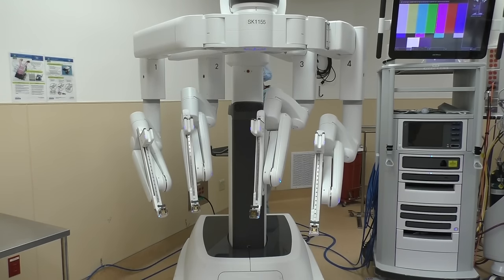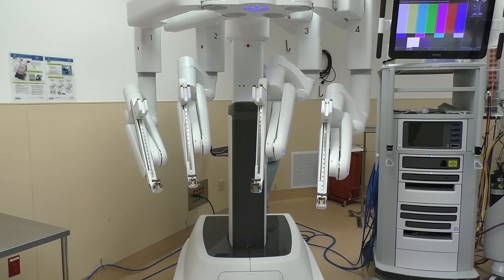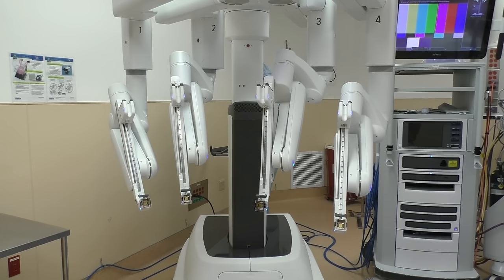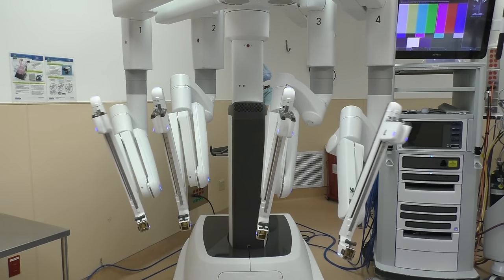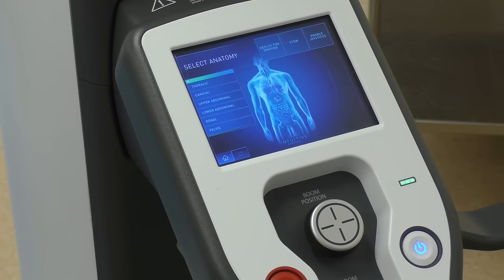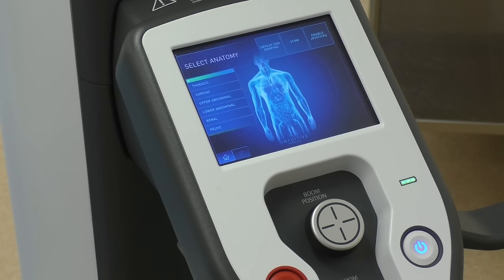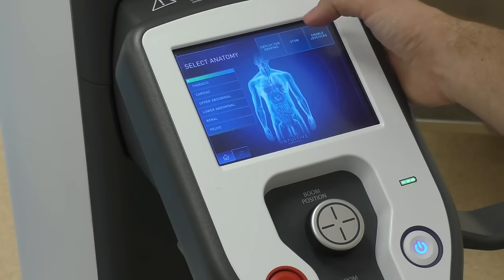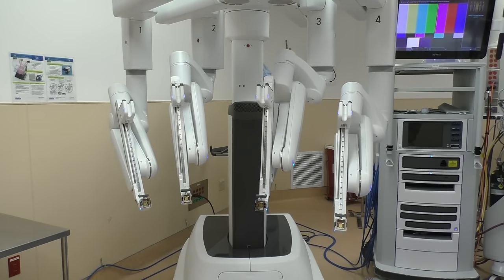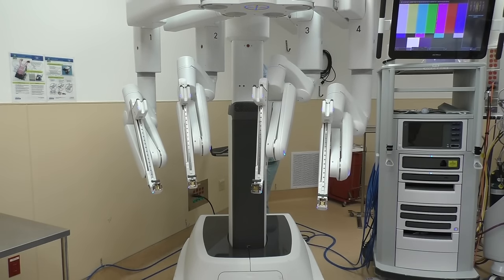Just click and hold the button and the robot will move itself into place and it's ready to go. Stowing the robot after the day is another easy thing to do — just hit that stow button, hold it, and it brings it right back into stow mode so you can place it in the corner of the room after you're done with the cases for the day.